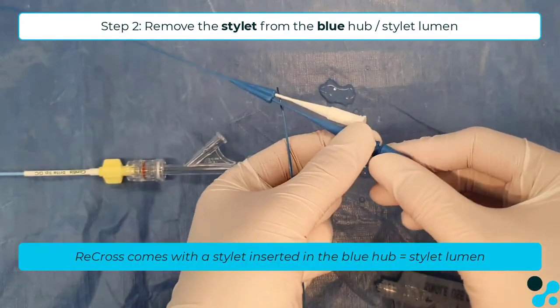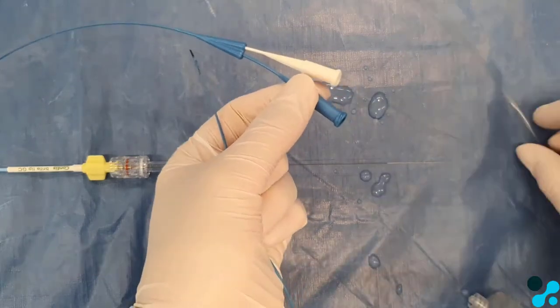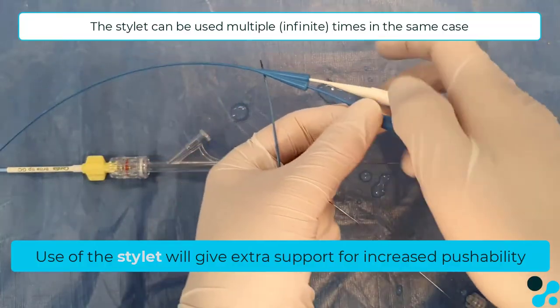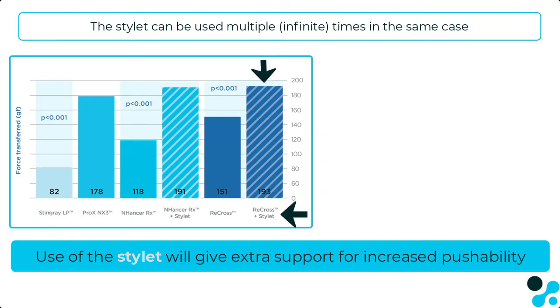The blue hub comes with the stylet inserted. Take it out and flush that lumen as well. Bring it back in and use it during insertion of the Recross device. The stylet gives higher pushability during insertion and advancement of the device.